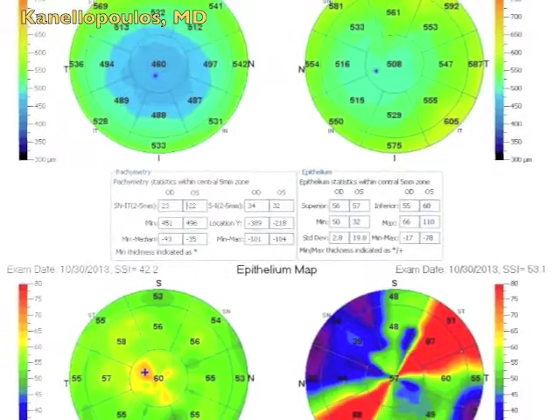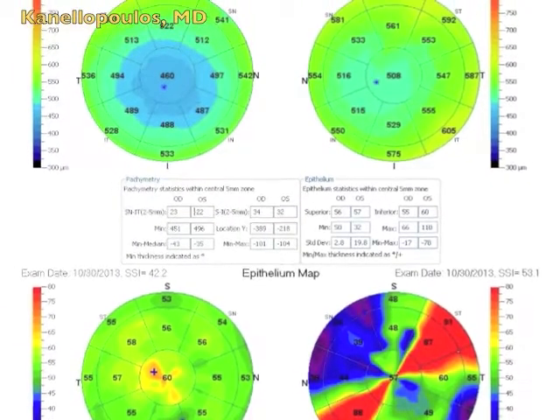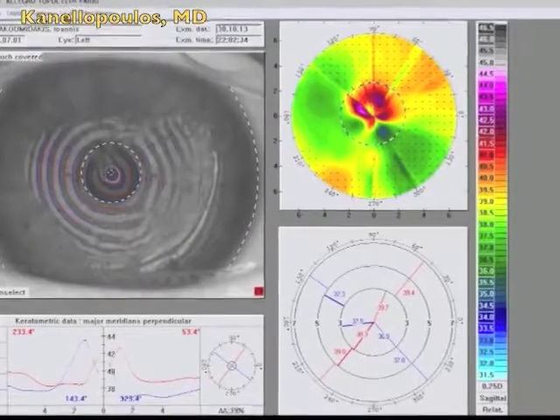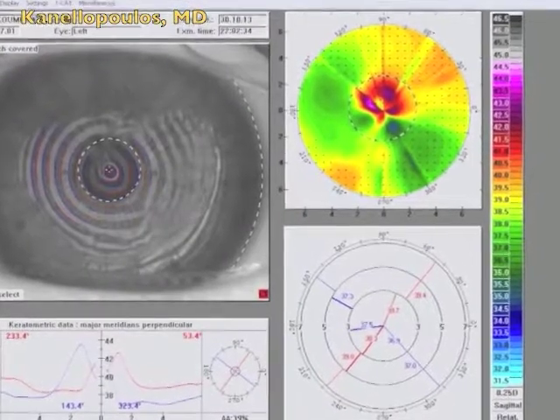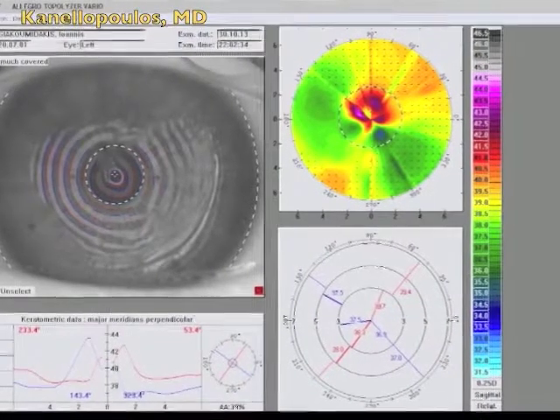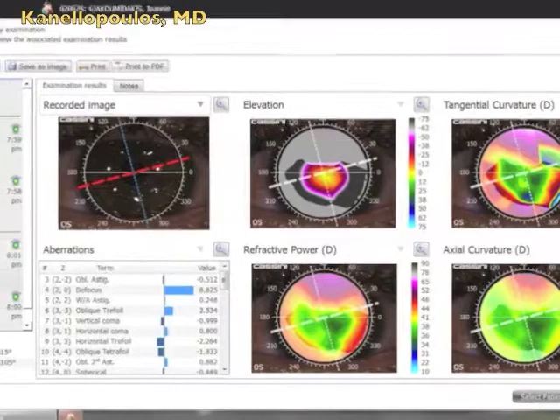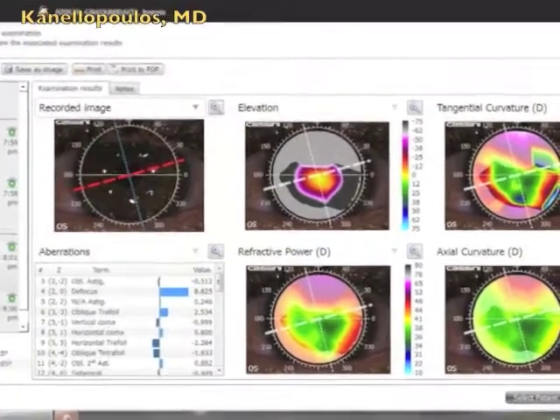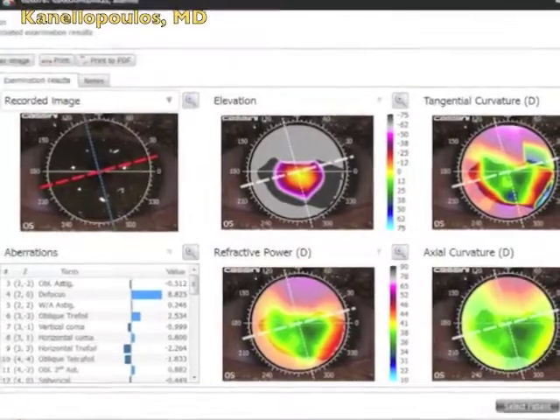These are the OCT maps. The right eye is normal. The left eye is the abnormal eye, and you can see the abnormal epithelial on the bottom right. These are the Placido topography images showing the extreme irregularity, both on the rings and on the topography. This is the Cassini multi-spot LED reflection topography, and you can see the very serious irregularity.